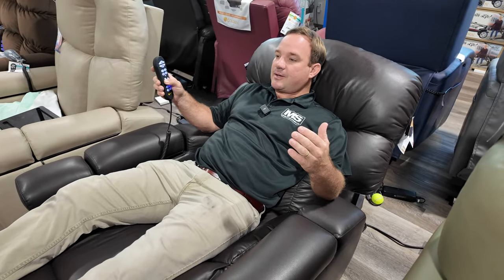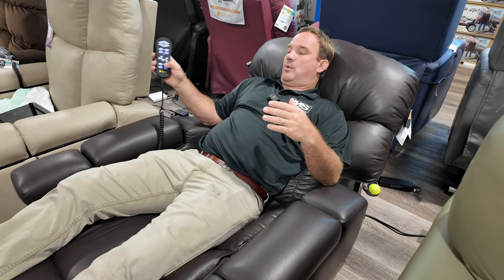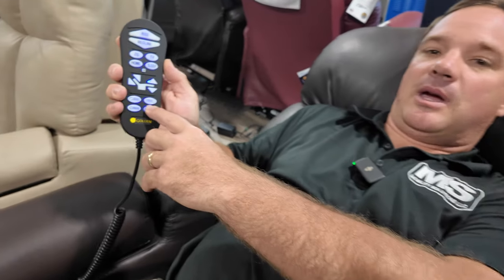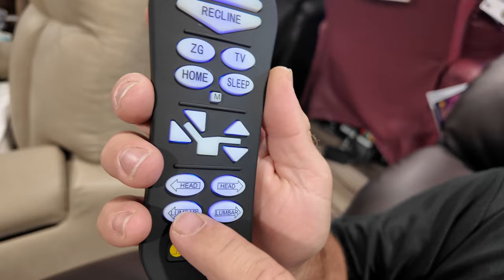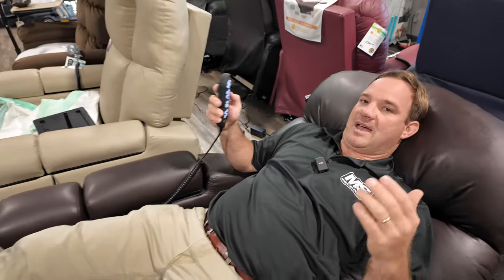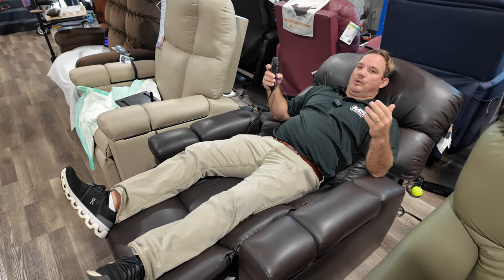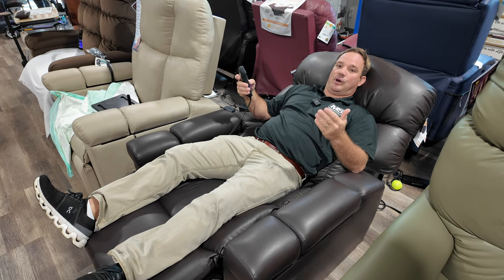You can recline it back to a position you like — maybe this is your sleeping position. You can adjust the head back and forth, and it has lumbar that pushes your back out, similar to a vehicle lumbar. If you need feet above the heart, you can do Trendelenburg with this chair, but we also have other chairs in our Twilight series made specifically for getting your feet above your heart.